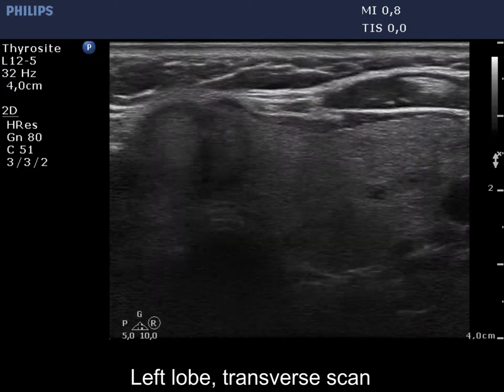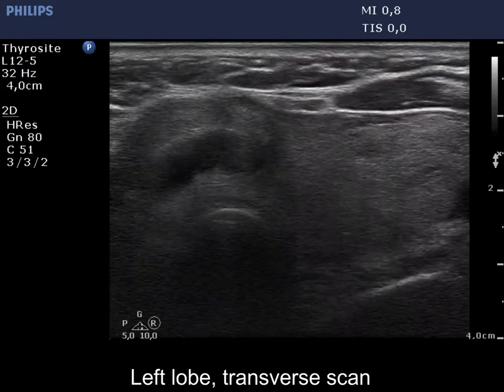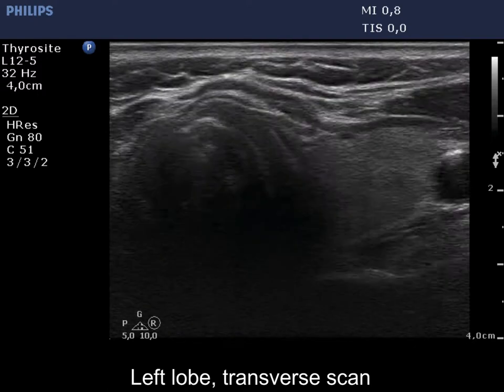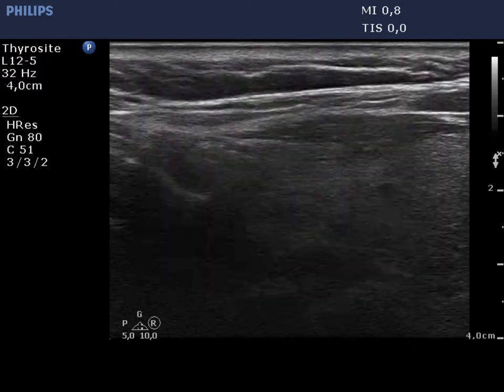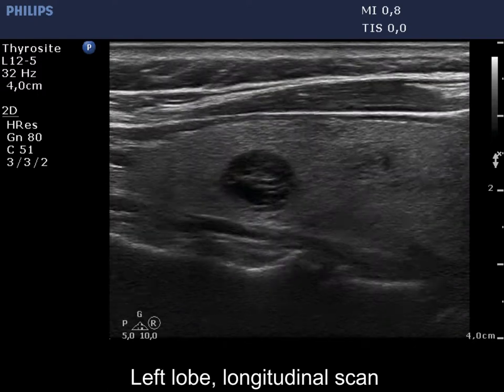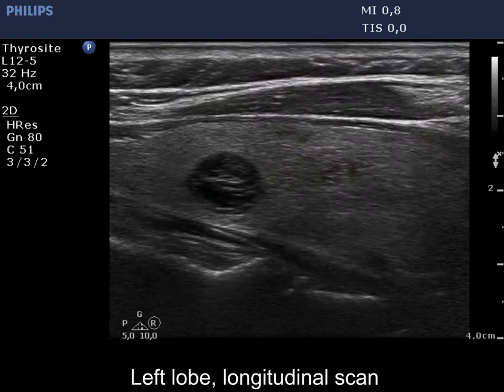The left lobe has a similar appearance. The lesion presented here contains back wall figures caused by posterior enhancement.